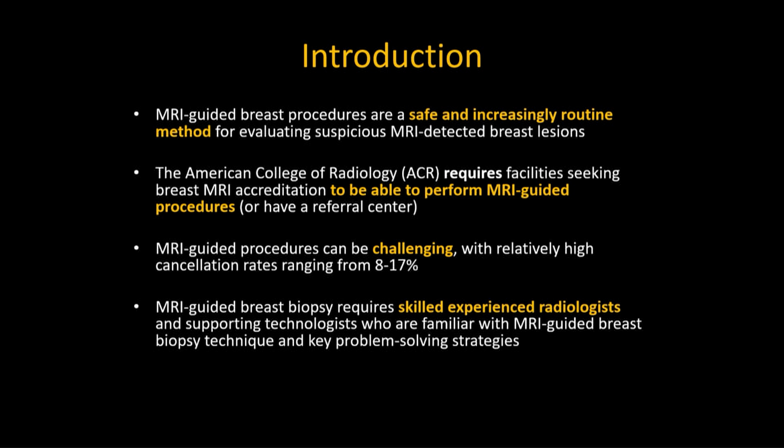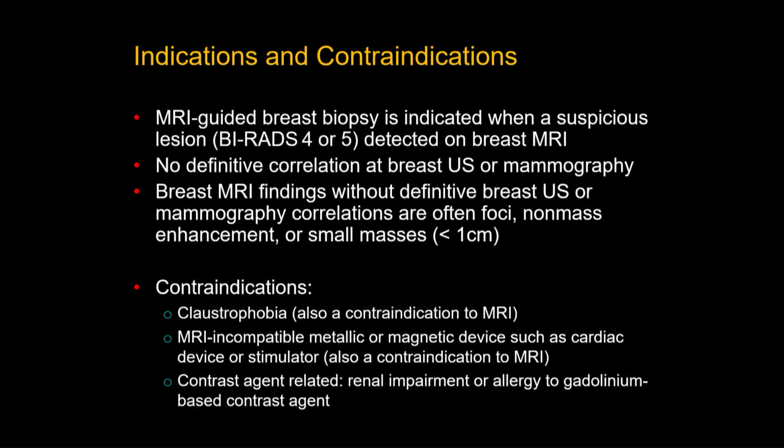But MRI-guided procedures can be challenging. They actually have relatively high cancellation rates, ranging from 8 to 17%. Therefore, MRI-guided procedures require skilled, experienced radiologists as well as skilled supporting technologists who are really familiar with the MRI-guided procedures, the techniques, and can offer some key problem-solving strategies.